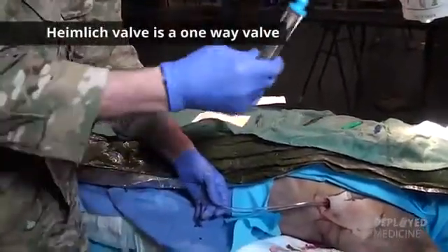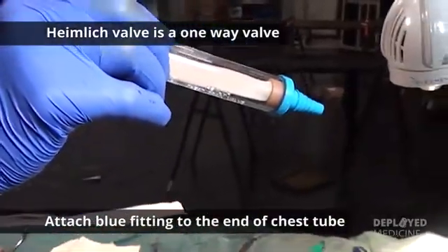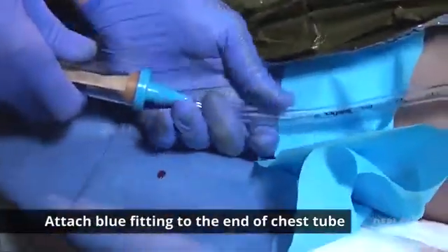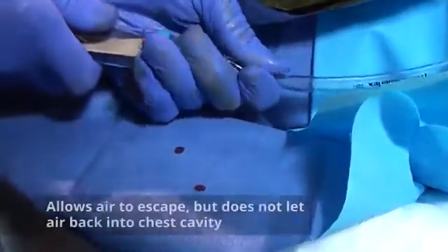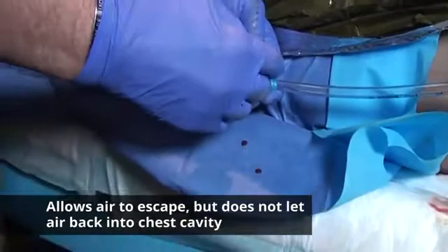Your Heimlich valve, it's a one-way valve. If you don't know which way the end goes, the blue end goes on. It's a one-way valve, allows air to escape and does not allow air to go back into the chest cavity.